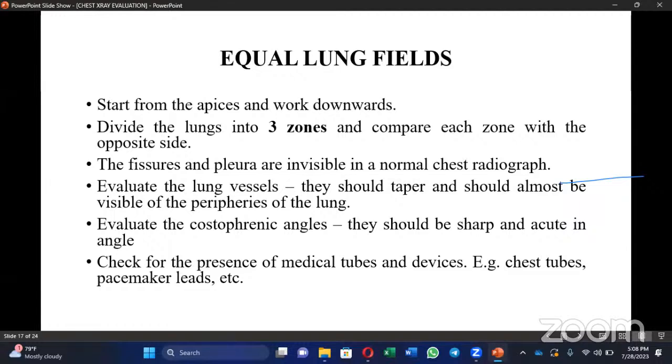So it is very important to look at the lung fields and rule out anything that is causing the lung to lose its radiolucency. Okay, so when there is a pathology, it can either come as a result of the area being very radiopaque, when we say radiopaque, it becomes white, or there's a very significant radiolucency. That's very dark areas within the lung areas. These are all things that we have to look out for when we are assessing the lung fields.